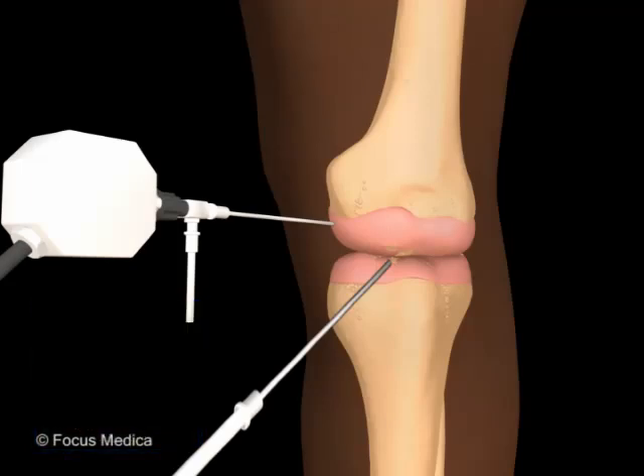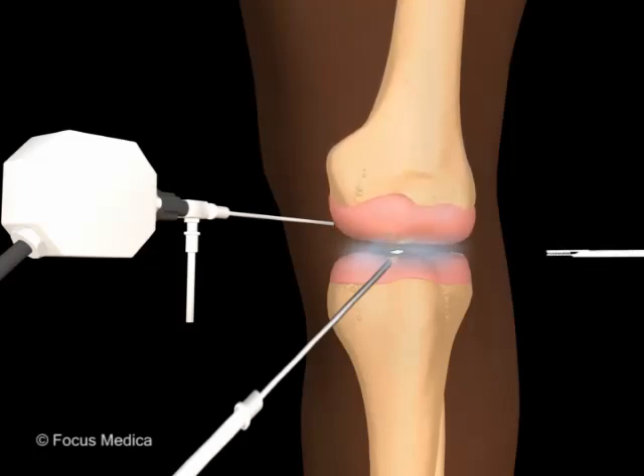During lavage, saline is flushed into the joint and the collected blood, fluid, or pieces of tissue are flushed out. In debridement, however, loose fragments of bone or cartilage that are still adhering to the bone surface are scraped out.